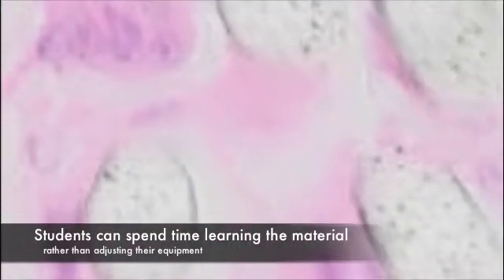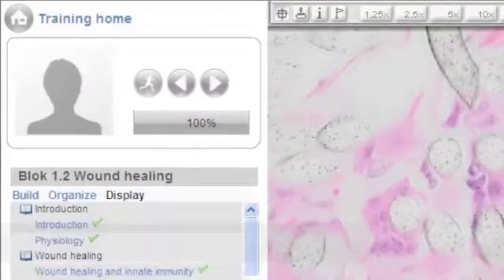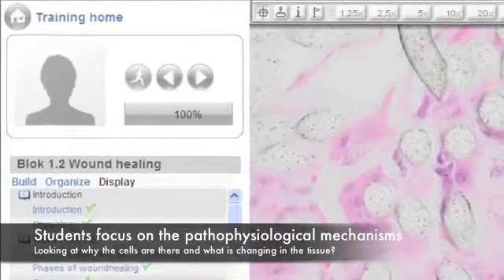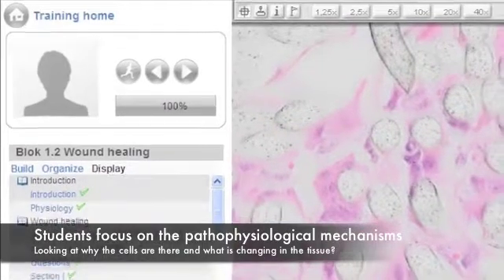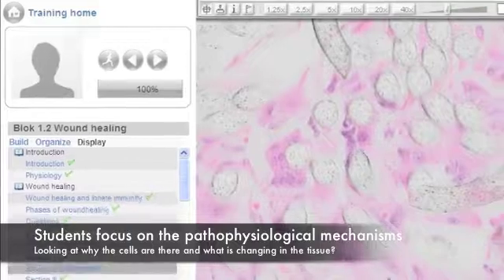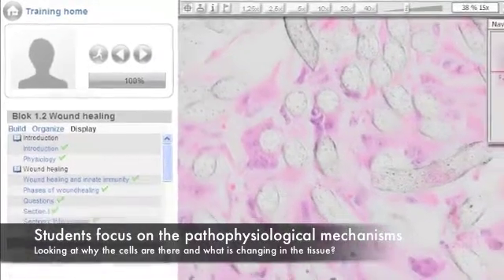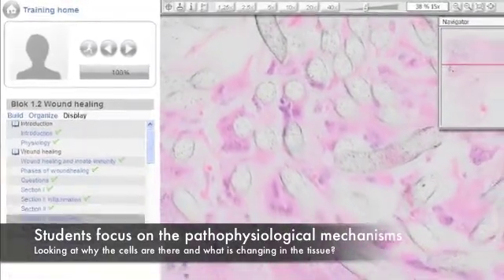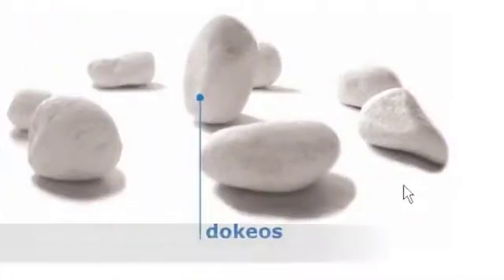What's the most important thing? It's not adjusting the microscope, but it's recognizing what's there. But also much more than that, not only seeing a picture and recognizing it, but also the pathophysiological mechanisms behind it. Why are those cells there and what is changing within the tissue? So it's much more than only looking at a nice picture and recognizing whether it's a Ferrari or a VW or something like that. The background information is obviously very important as well.